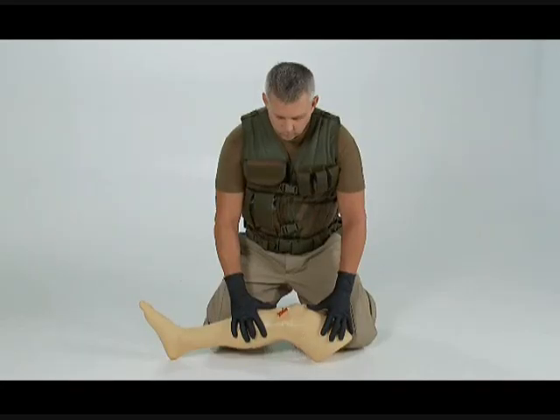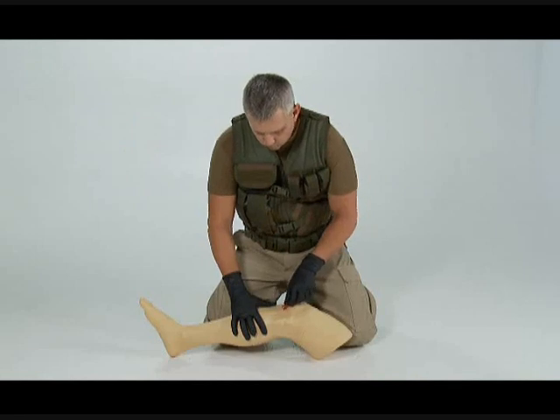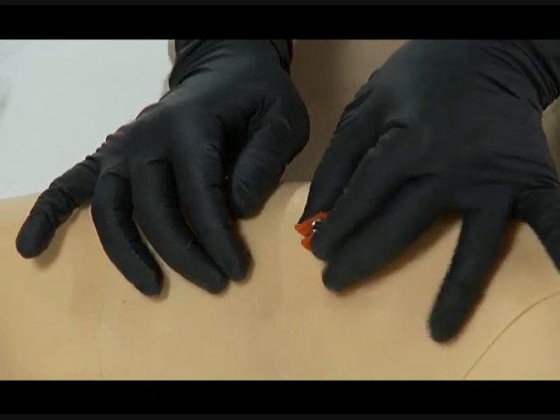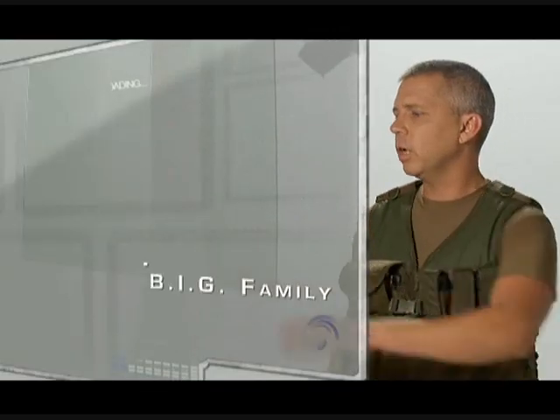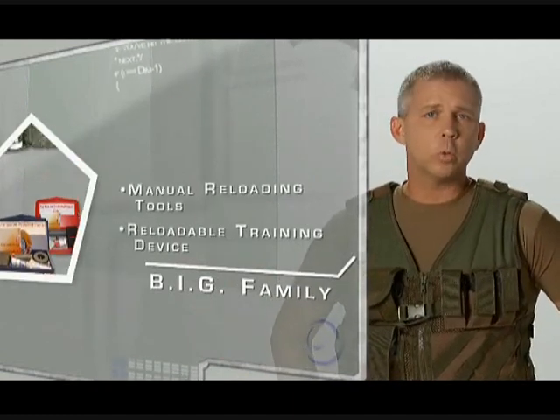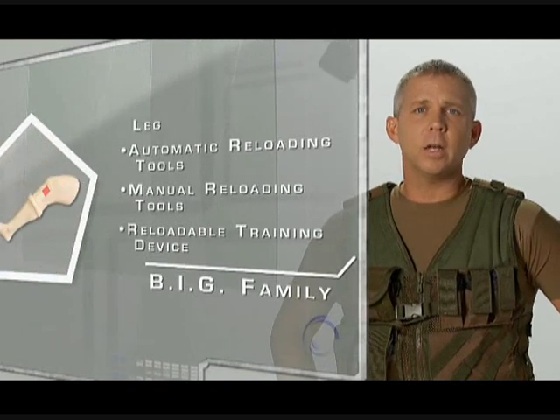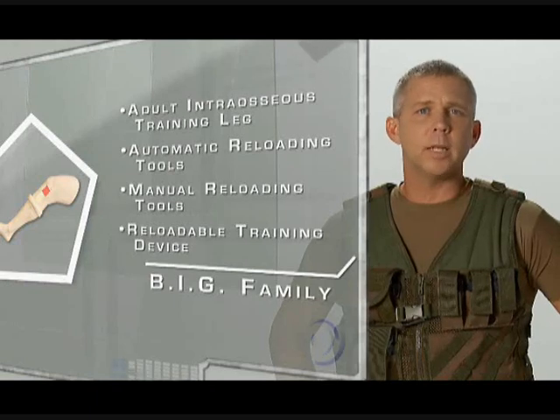To remove the cannula from the bone, use the square notch in the red safety latch by placing it around the cannula hub. Pinch the combination between your fingers and pull straight up. Some twisting may be required. The Bone Injection Gun family of products includes reloadable training devices, manual reloading tools, automatic reloading tools, and the first of its kind adult intraosseous training leg complete with replaceable skins and simulated bone cartridges.